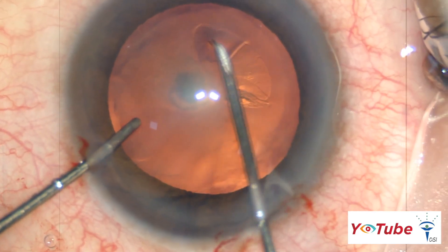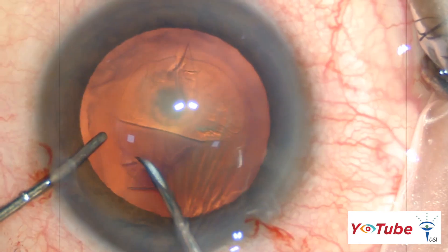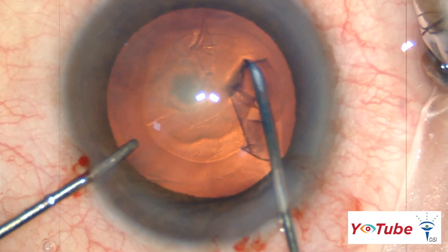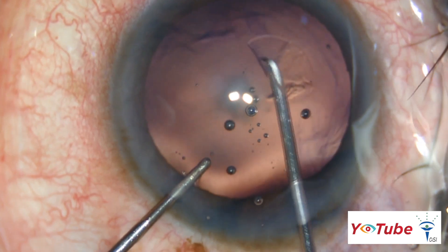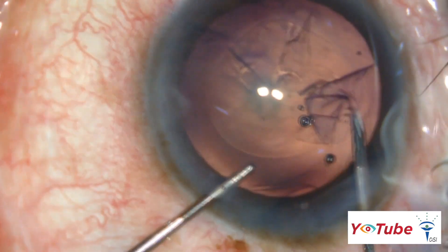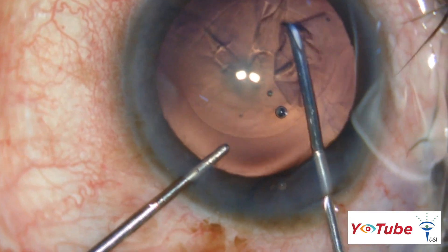We should aim for a capsulorrhexis size of around 5 mm. A larger rhexis may not leave adequate space for a sulcus-fixated IOL in case of a posterior capsular rent. The rhexis should also not be too small, as this may lead to increased hydrostatic pressure during hydrodelineation and cause a posterior capsular rupture.